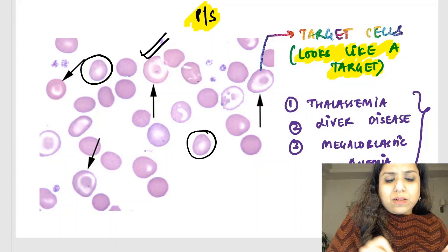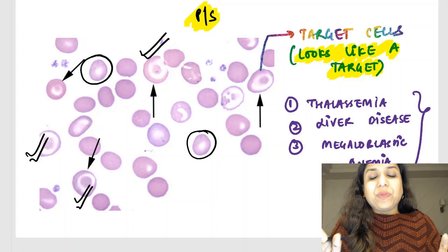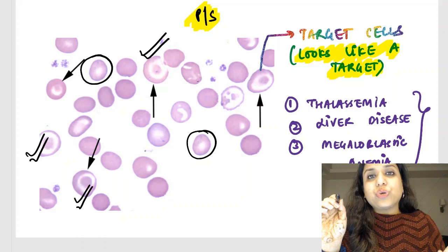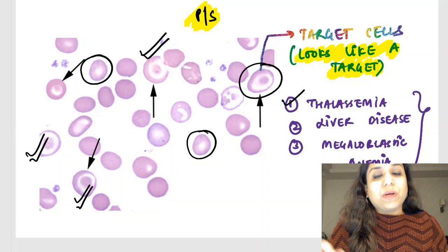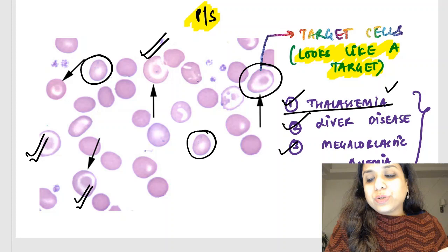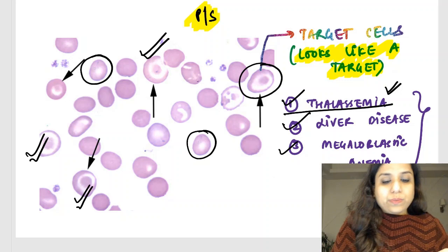Can you see these are the normal RBCs, but look at this cell — do you think this is a normal cell? It looks like a target, like from the game of darts. So these are called target cells, and they are seen in thalassemia, liver disease, or megaloblastic anemia. Thalassemia is one of the most common causes of target cells, and thalassemia will also show microcytic hypochromic RBCs — smaller and less color.